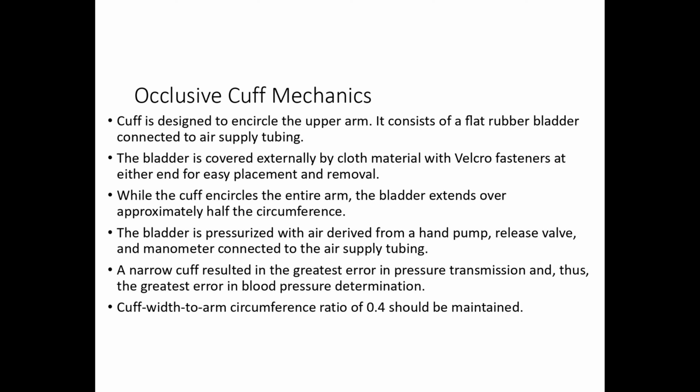When the pressure is released, the cuff shape deformation proceeds at low pressure until the bladder reaches its final geometry, and it gives a pressure volume relationship, a curved graph. When you put on a high pressure, that results in a linear relationship. This model was useful in linearizing the curve for use in plethysmography.